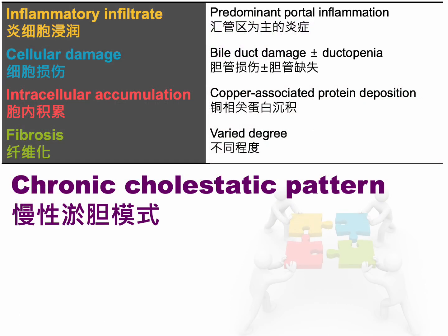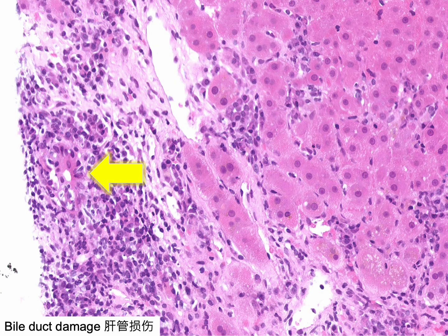Let's proceed to the final pattern of cholestatic injury, known as the chronic cholestatic pattern. This pattern is characterized by portal-based inflammation, bile duct damage, ductopenia, chronic cholestasis, and portal-based fibrosis. A portal tract exhibits a damaged bile duct with epithelial disarray and a lymphocytic infiltrate, accompanied by a marked plasma cell-rich portal inflammation.